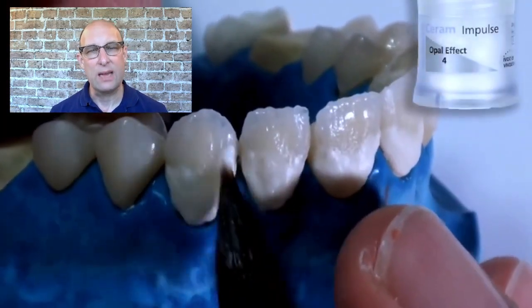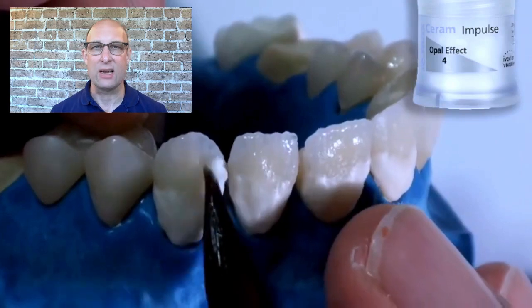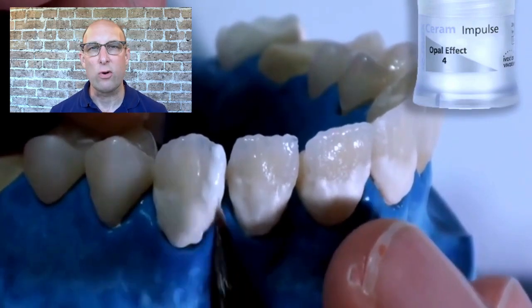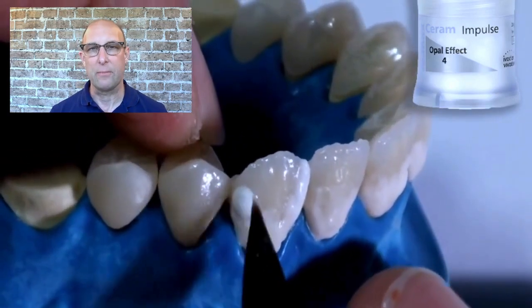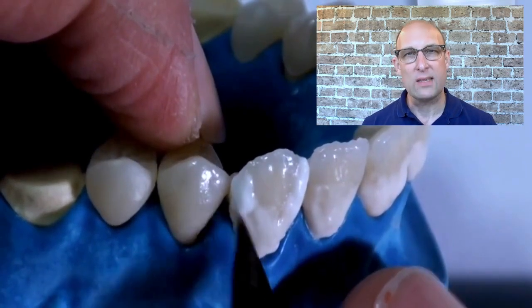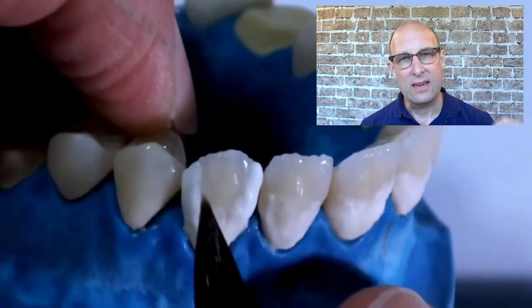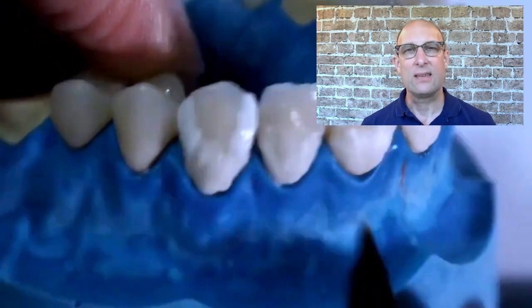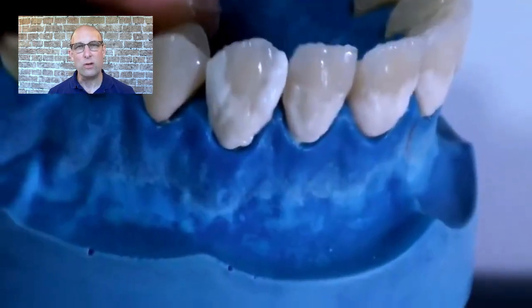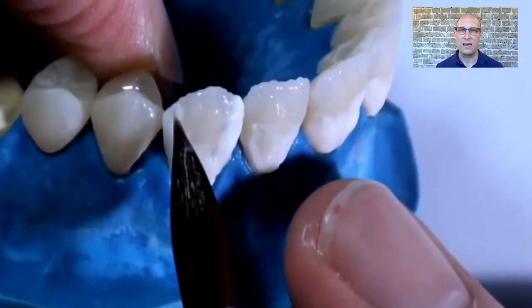I usually use OE5 as a secondary dentin bake to create those nice translucent white line angles you see sometimes. I'm using OE4 on the mesial and distal and extending it over the incisal edge a little. You could also use OE3 if OE4 is too wide, or mix OE4 with Neutral 50/50. In micro layering, don't make the OE4 too thick — adding too much will make it turn too white. Feather it into the gingival porcelain to create a nice transition without a hard stop.